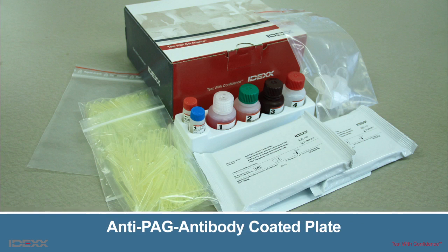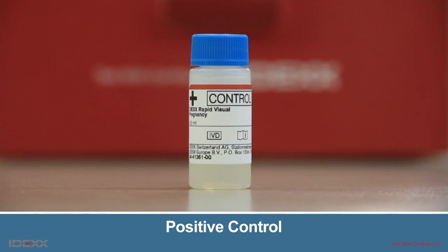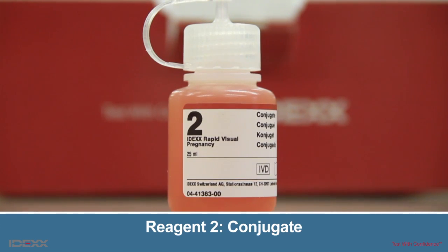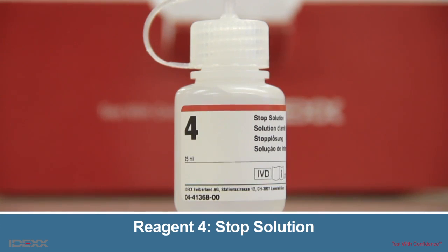The IDEXX Rapid Visual Pregnancy Test Kit includes two anti-PAG antibody-coated plates, one positive control, one negative control, Reagent 1 detector solution, Reagent 2 conjugate, Reagent 3 TMB substrate, and Reagent 4 stop solution.